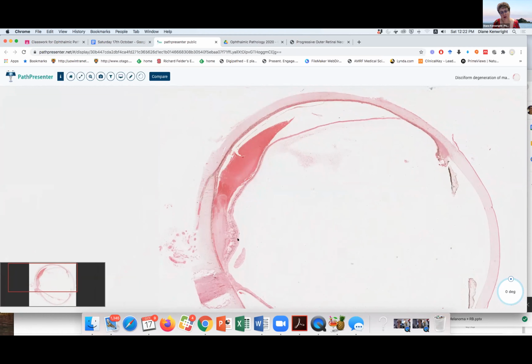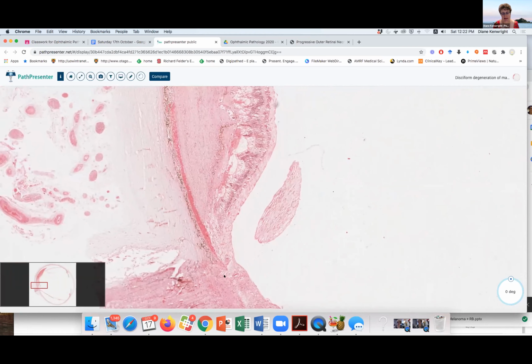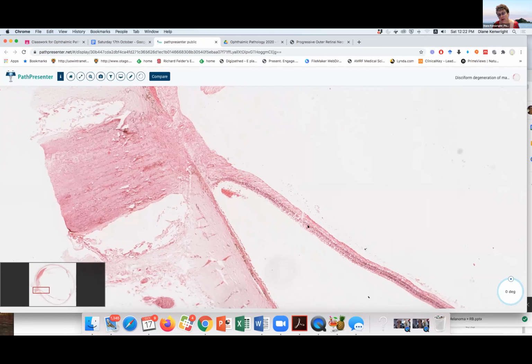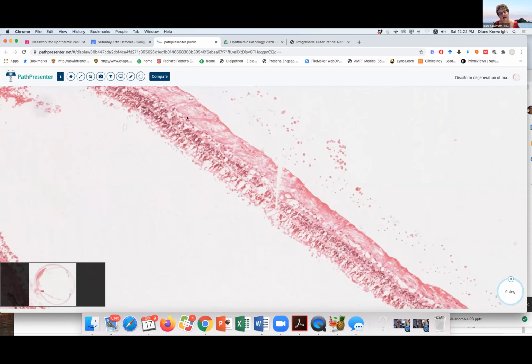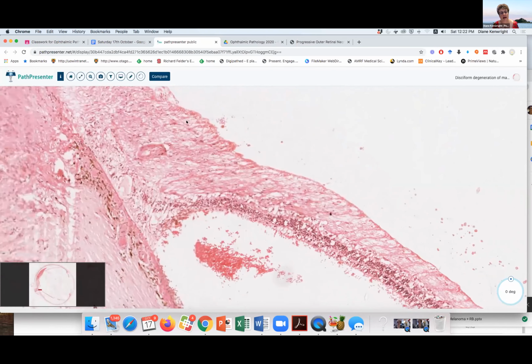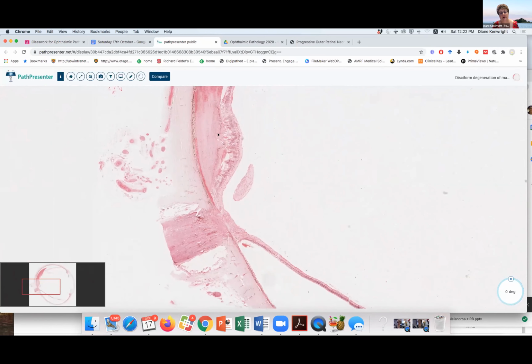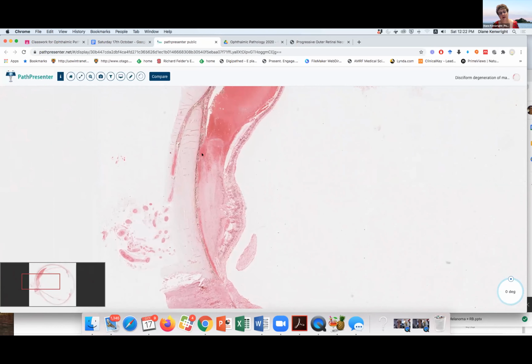Yeah. So we're dealing with an area of scarring in the posterior retina, something as anatomic pathologists we aren't expert in, because these eyes don't come out. So let's look here. Yeah, there does appear to be some optic nerve atrophy. Let's look here. It's the ganglion cells. So there does appear to be some ganglion cells, though they might be decreased in number. So I'm not ruling out glaucoma just yet. We'll go and have a look at the anterior eye. So we've got something that looks like this disciform scar here.